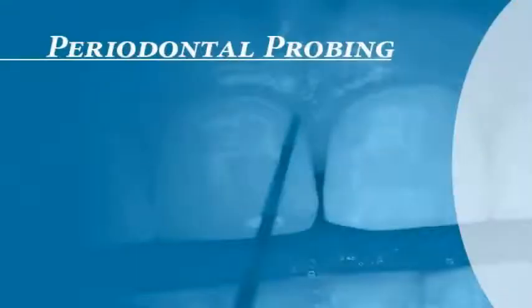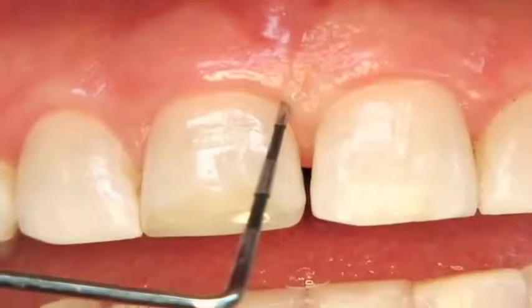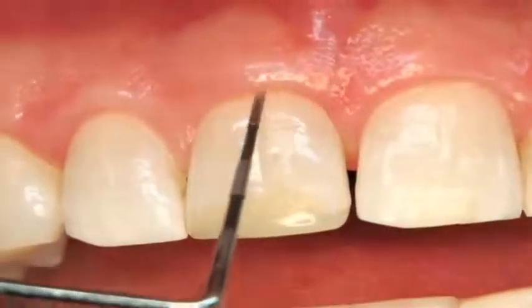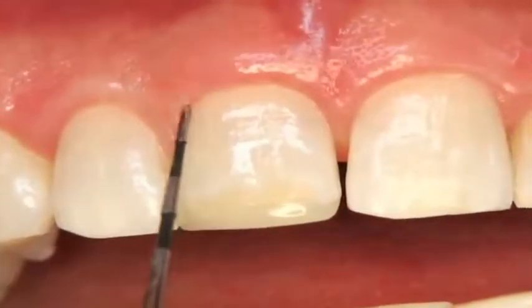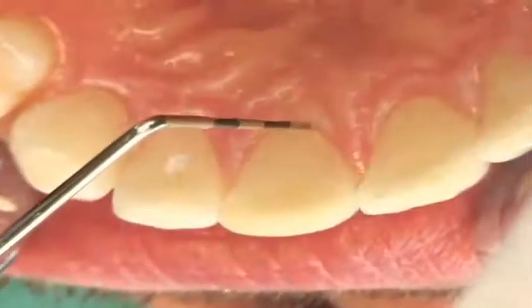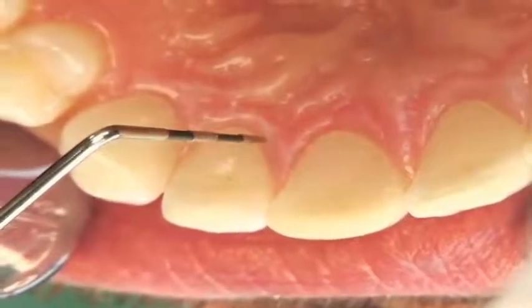Periodontal probing. Periodontal probing is an important clinical test that is often overlooked and underused for diagnosing periapical lesions. A periodontal pocket of pulpal origin is narrow. In contrast, periodontal pocket of periodontal origin is wide with different depths.